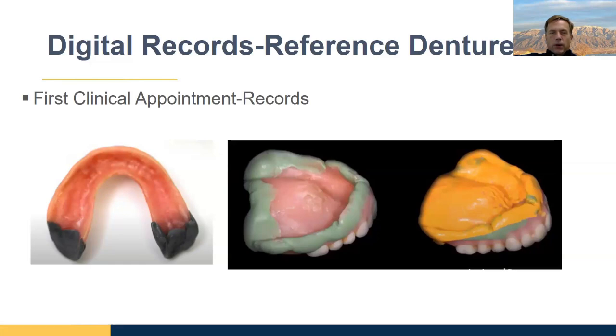Can you deepen the embrasures? Chairside, yes, as long as you have enough thickness. Sometimes with an immediate, the pink resin around the teeth is pretty thin, because with lab extractions, we tend to leave the ridge a little bit bigger, like it was with the teeth in place.